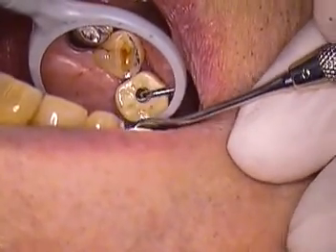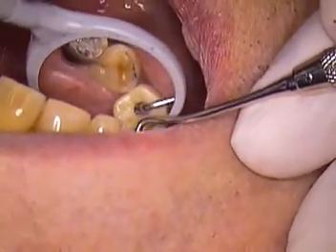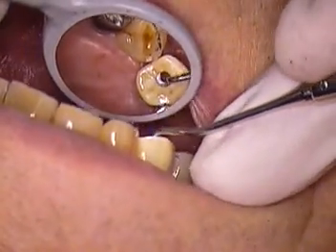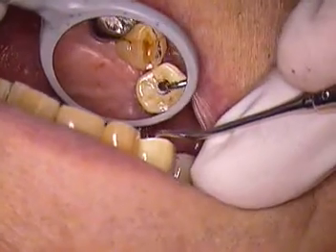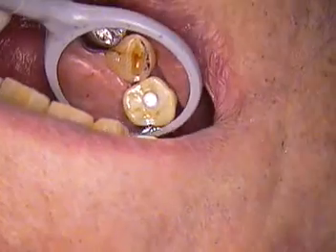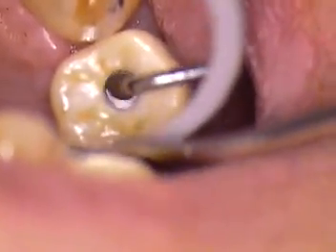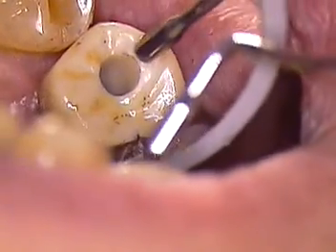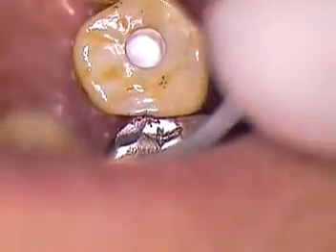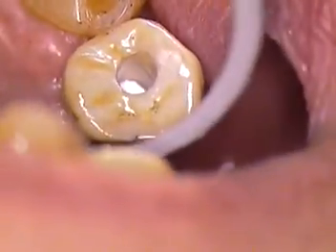We can do incremental bonding. You can use ParaCore — whatever you want to use. Condensing that in there nicely; that really does a nice job of sealing. It almost looks like plastic, way down in there, beautifully condensed. Since this is zirconia, we'll come all the way up to the top and place that composite in there as our final plug.